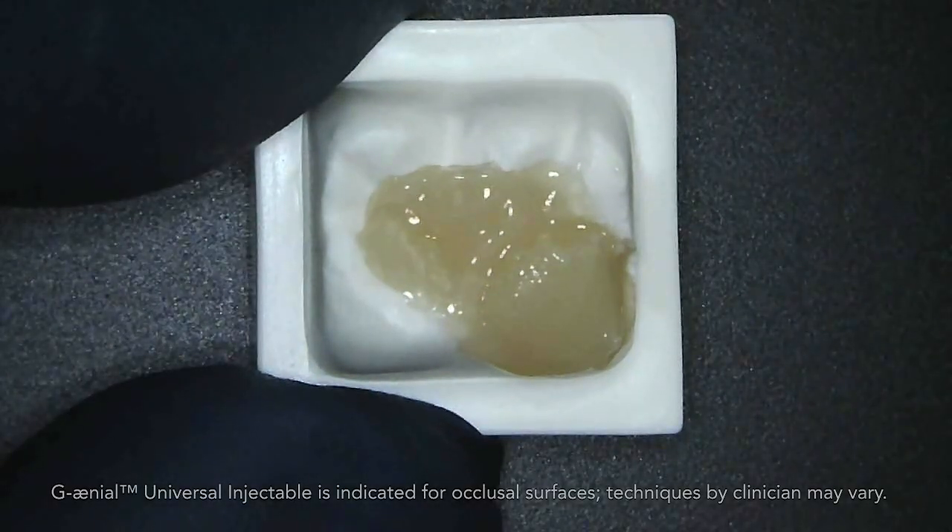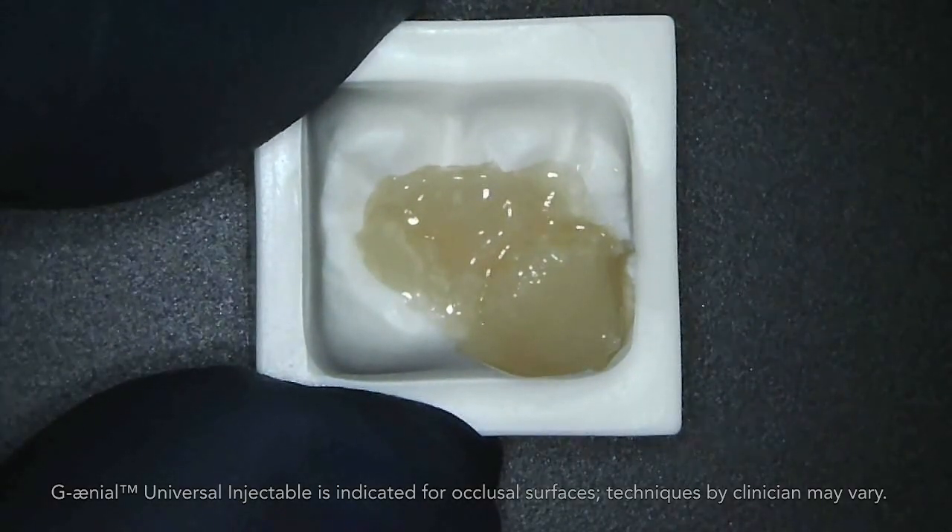What's unique about a restoration like this is it's supported internally with Everex Flow, which is a glass-reinforced composite that is extremely tough and resistant to fracture.